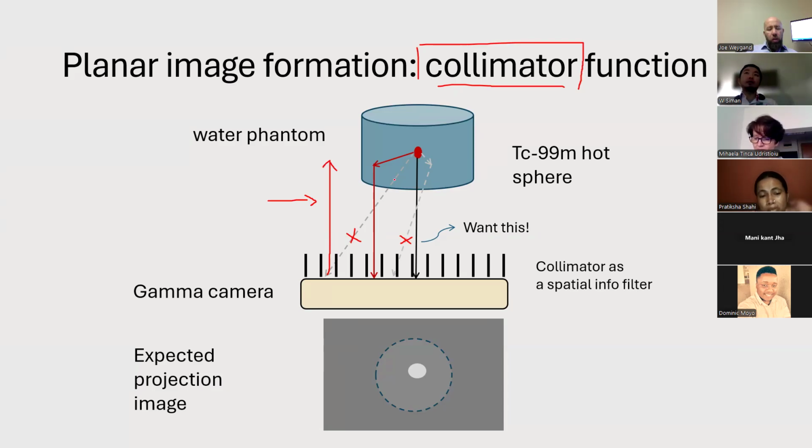And we discussed these two. One is the signal that we want. We detect it here, we can make the assumption it comes from north, so you place the signal here. So now you see the spheres. And when it comes from the side, I want to make an assumption that it's orthogonal, but then it gets cut off by the collimator. So it's gone. That's how you form the images.